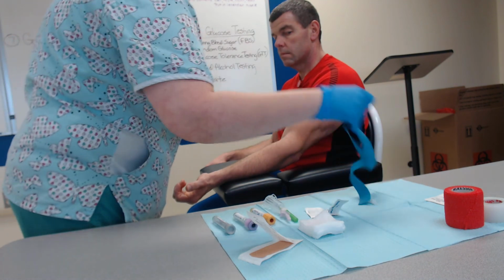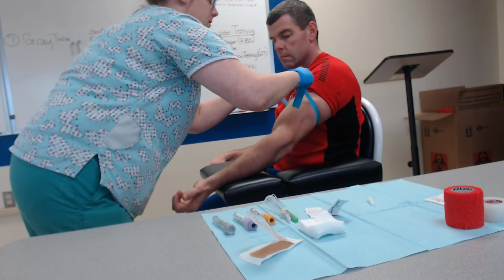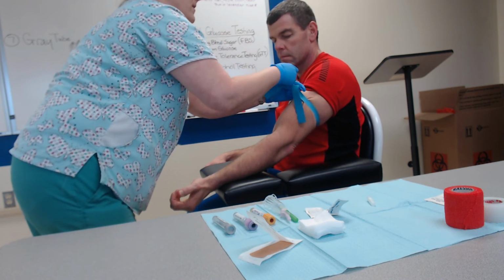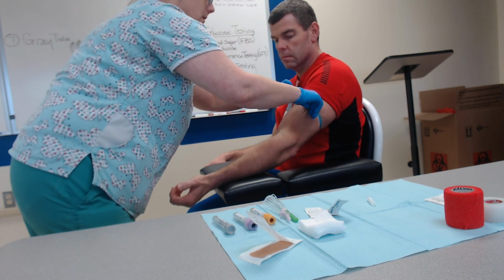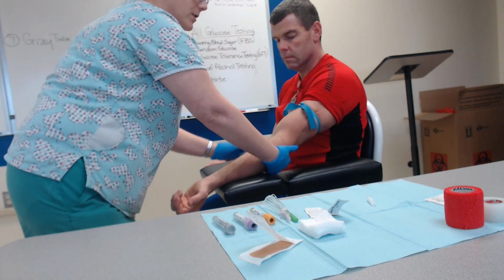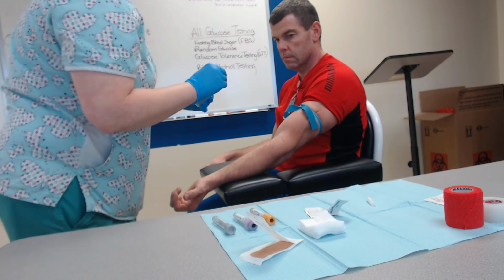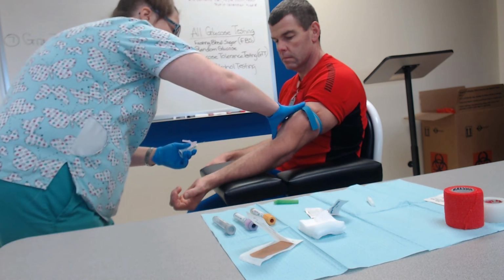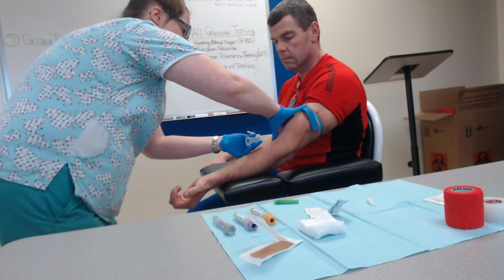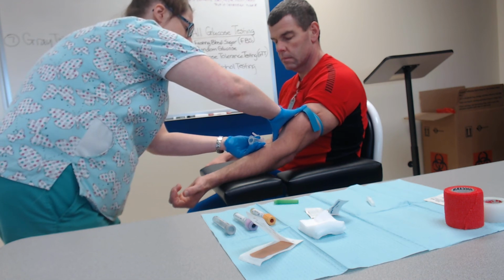Alright, so apply your tourniquet again. Remember that needs to be 3 to 4 inches up the middle of the arm so it doesn't get in the way of your venipuncture site. Go ahead and grab your needle, and you want to anchor your vein and follow the vein in whichever way that the vein is positioned.